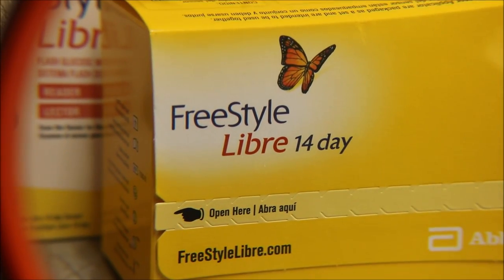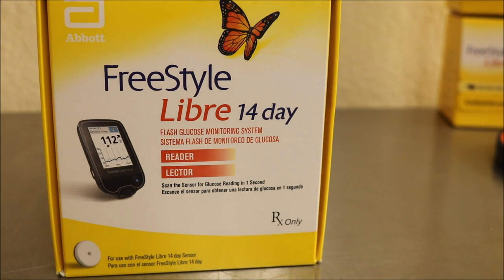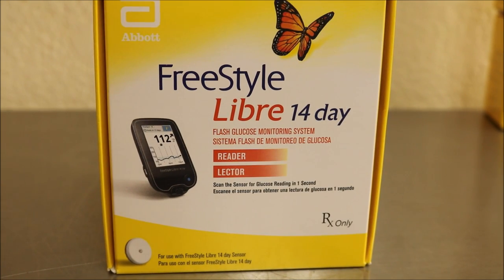So we're going to start here. I've got my magnifying glass ready because I'm pretty sure I won't be able to read the directions. This is the reader — it enables you to scan over the sensor, a little round thing that sticks on your arm, about as big as a quarter. You scan over it and it gives you a reading every 60 seconds. What would you rather do — stick your finger 120 times a month, or stick your arm once every 14 days?